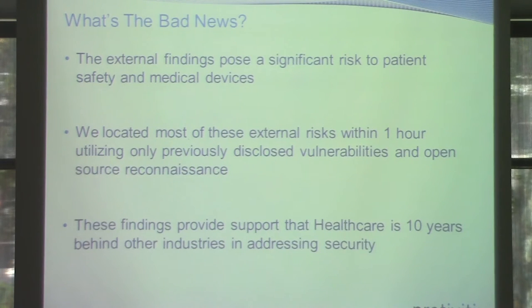So the bad news, what I show you here is really a misconfiguration inside thousands of healthcare organizations that are exposing medical devices to direct attack vectors. And then I'm actually going to talk about a use case at the end where the devices themselves are directly connected for a clinical reason, but have poor security practices in place.